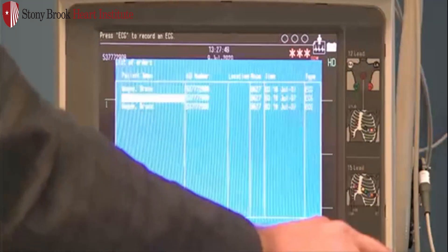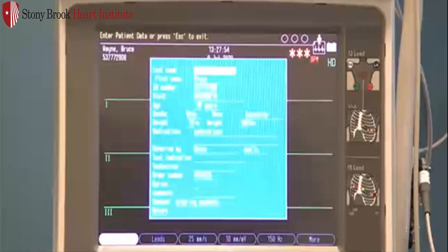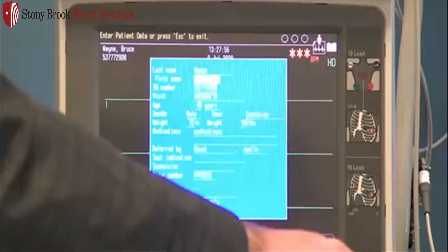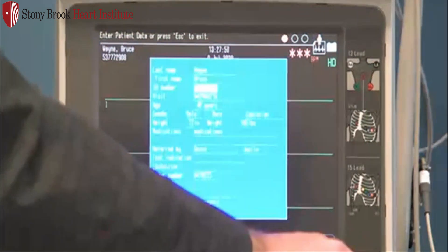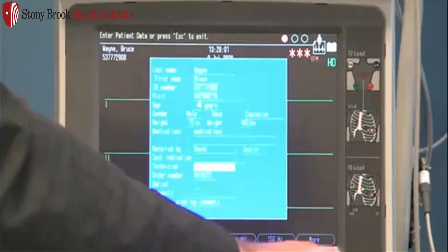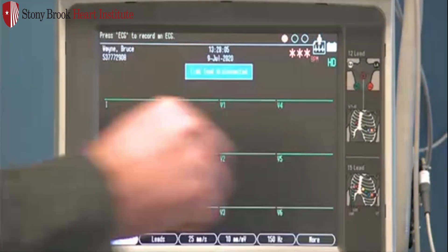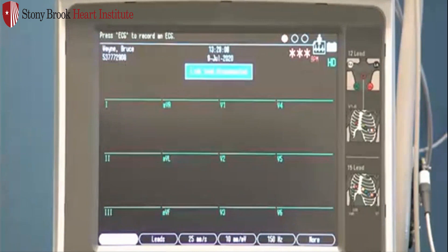From this list, I'm going to go ahead and select my order. You'll notice that the patient information is populated and that order field is filled. I can move through my screen here, adjust any of this information if I need to, select Return, and I'm ready to acquire my ECG and hook up my patient.